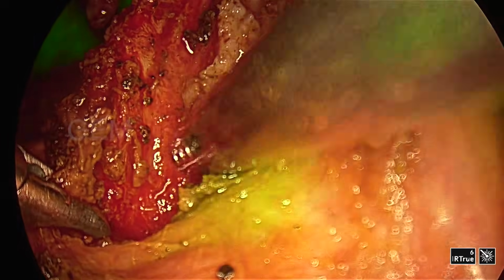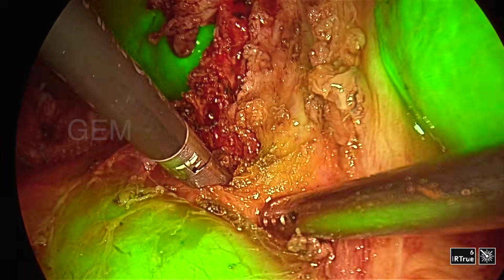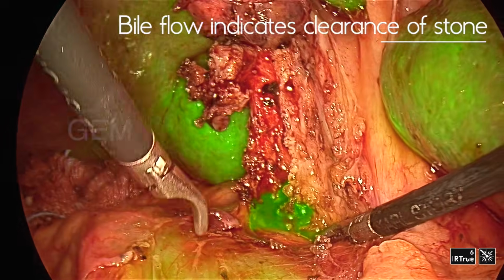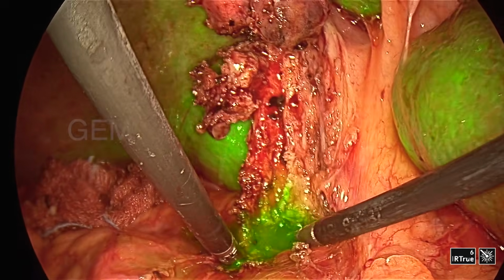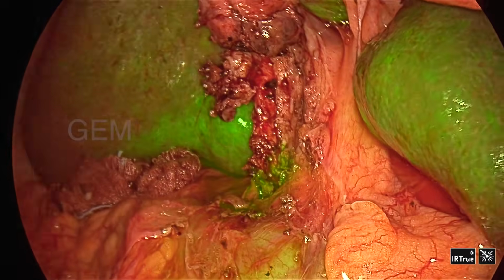See how helpful ICG is, and you can see the bile, how much fluorescent green it is, how much is coming. So the clear bile flow indicates clearance of the stone. It is coming out very nicely. So I am taking out all this debris material.